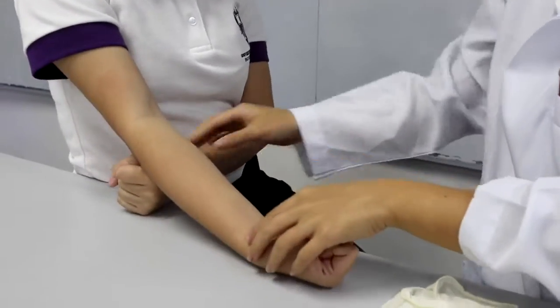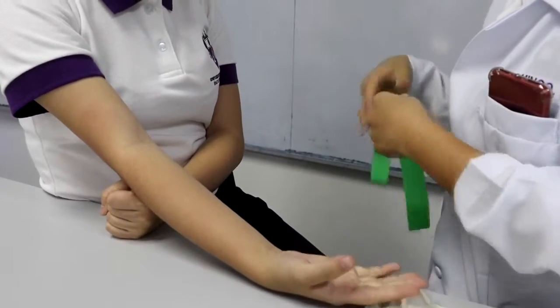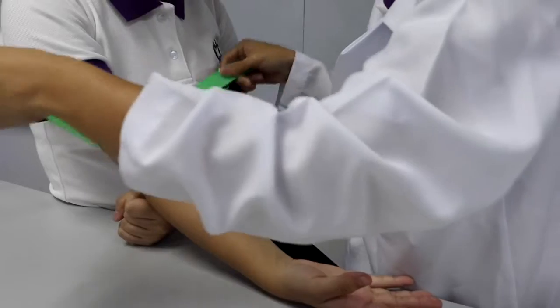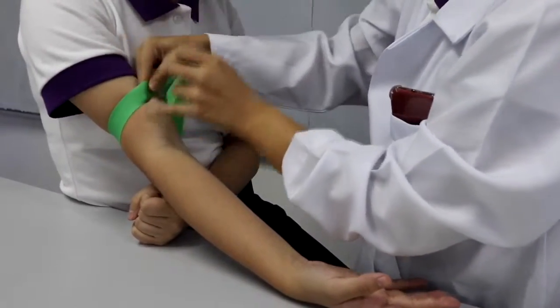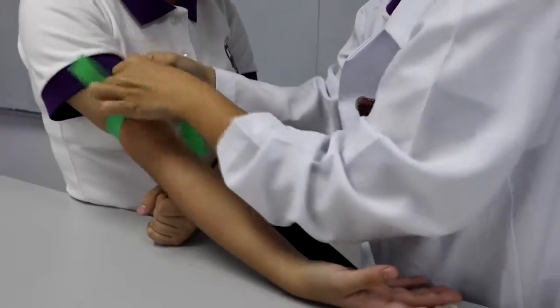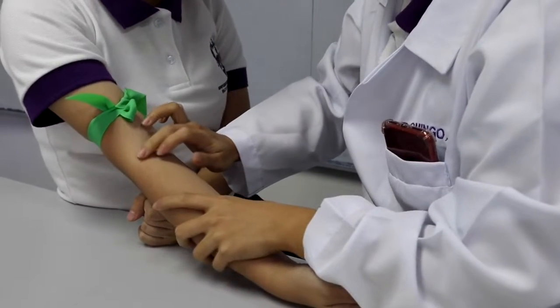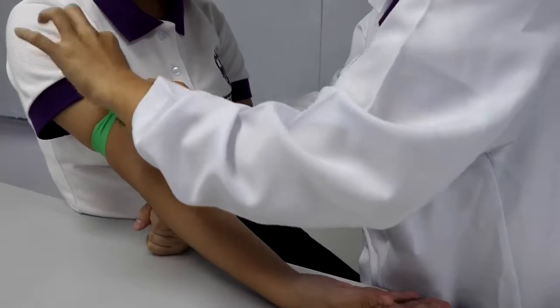Make sure that the arm is well supported, and then apply the tourniquet. Select the vein by palpating the site to be punctured. Once you identify the location, release the tourniquet.